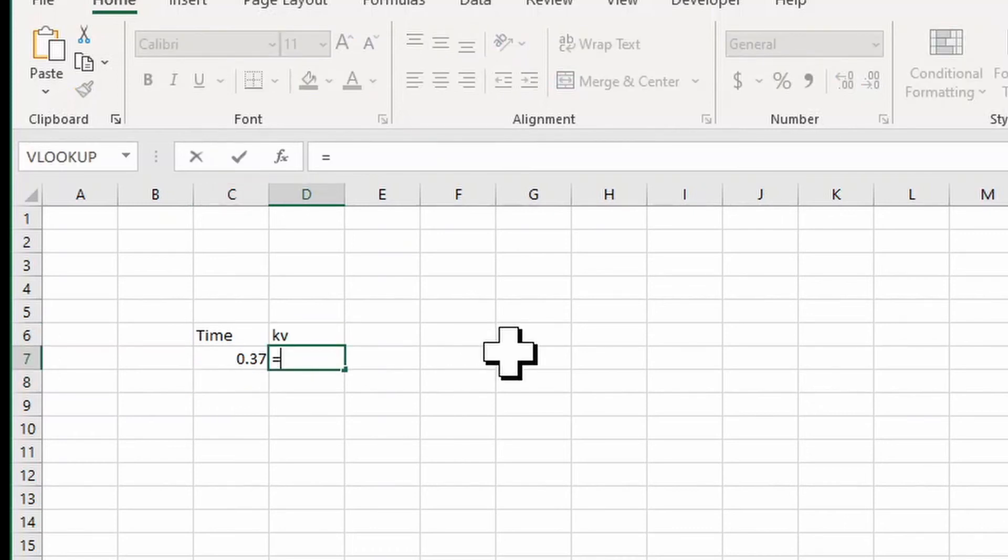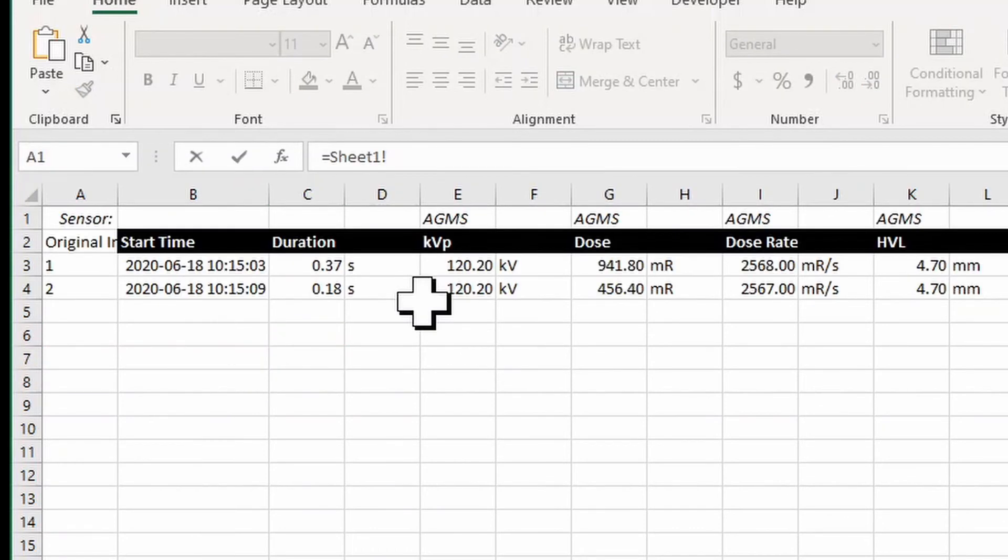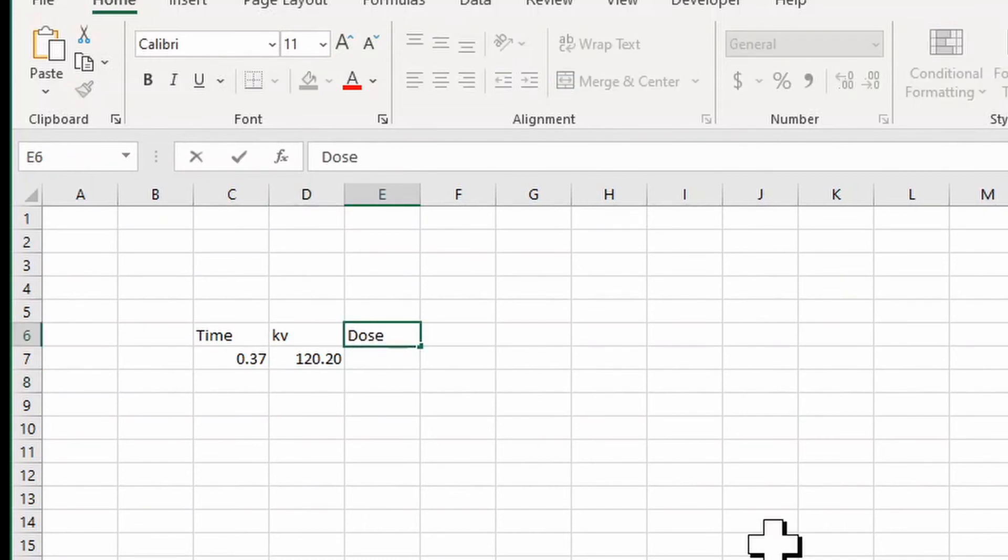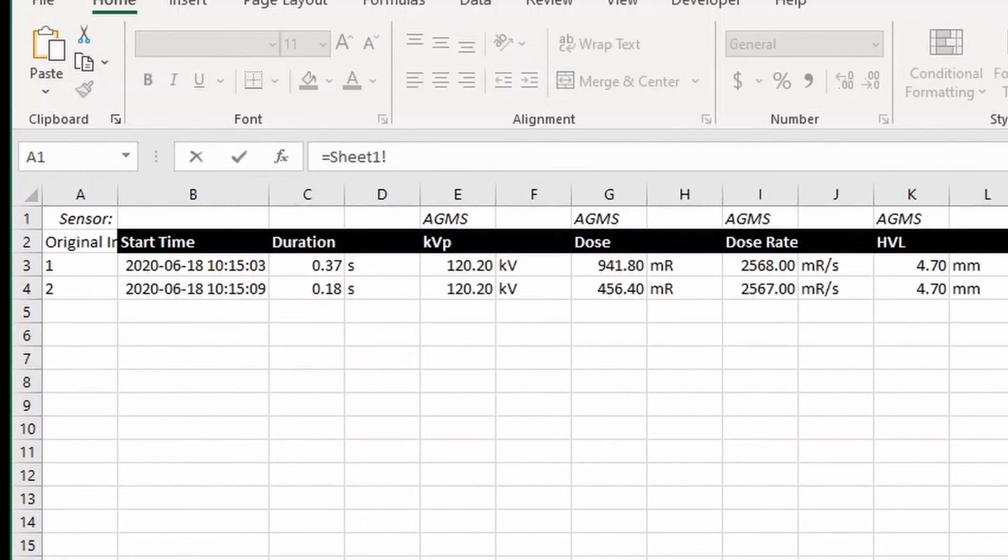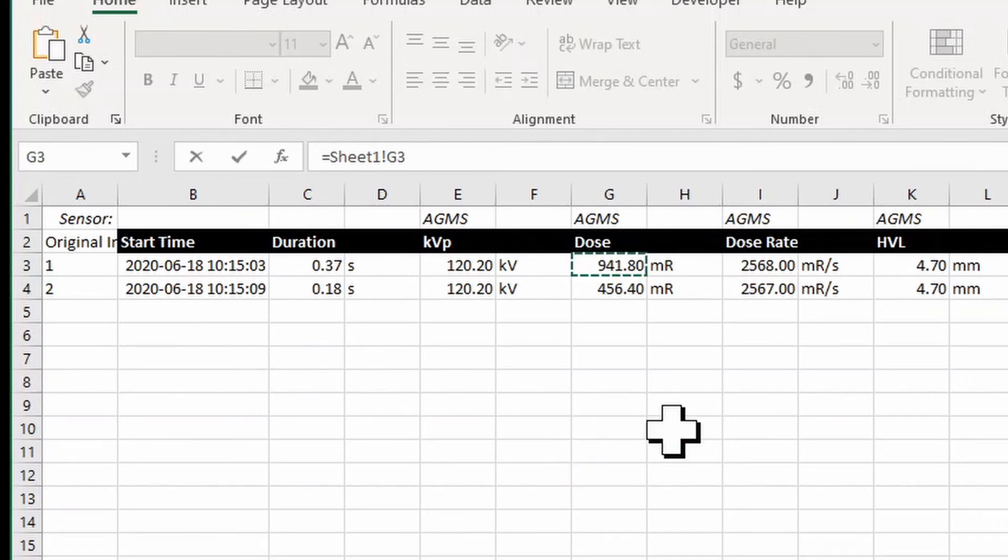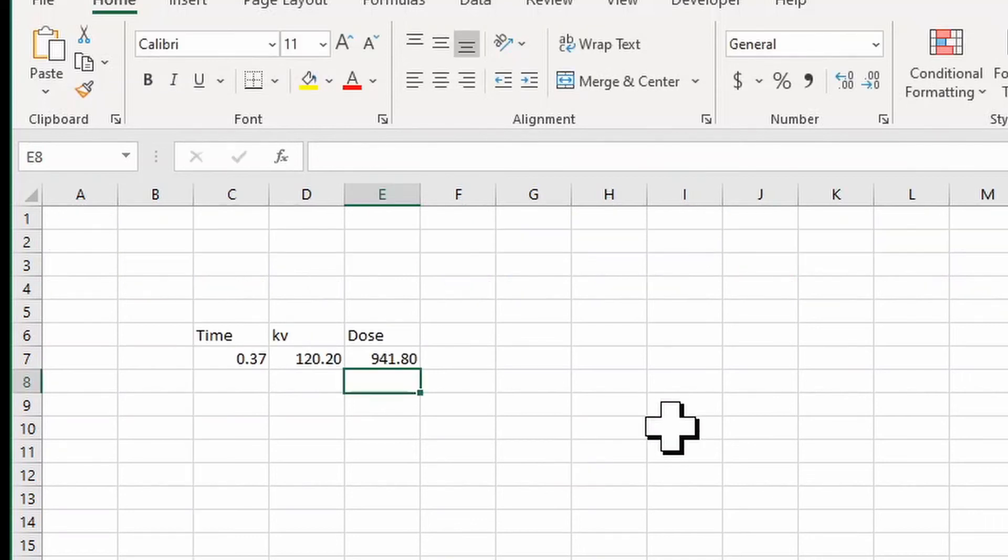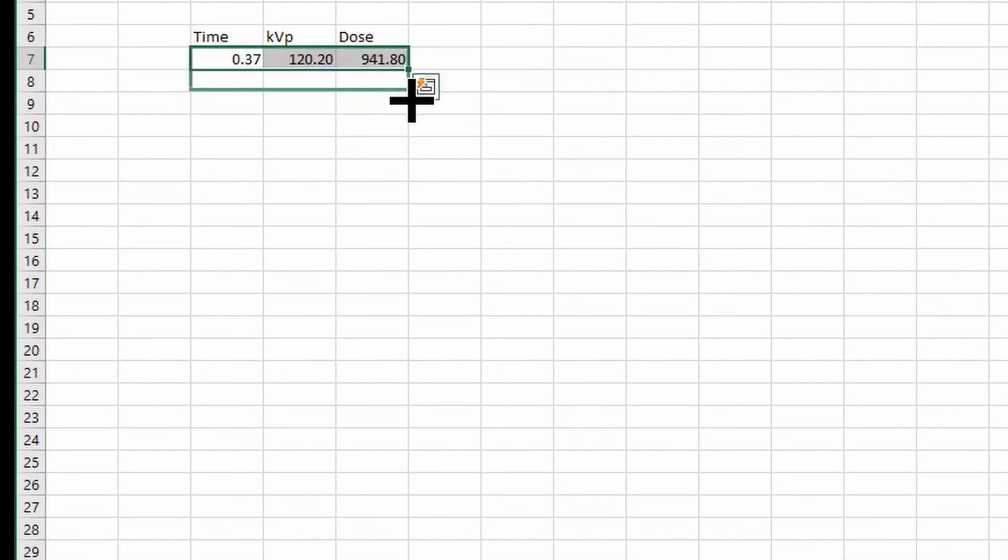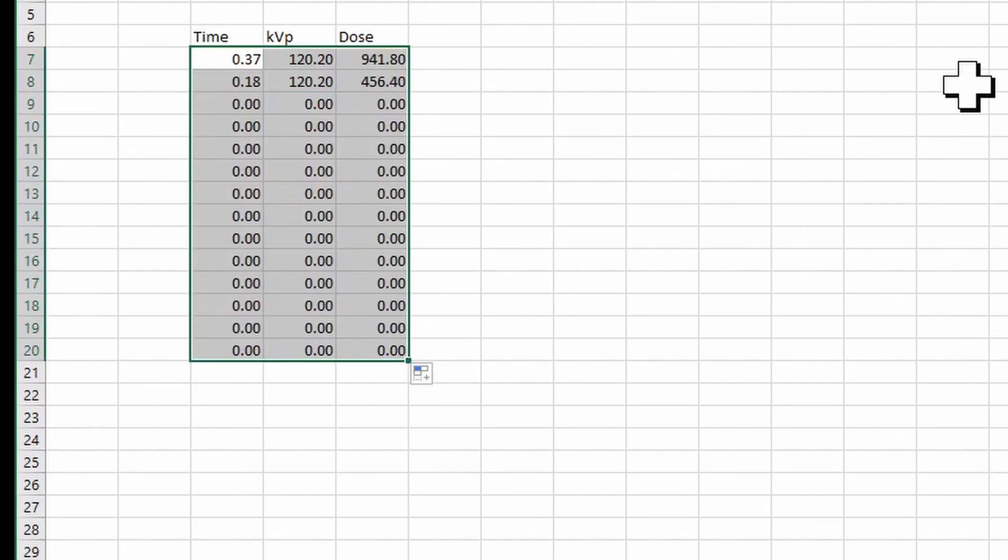We will repeat for KV and DOSE. You will not need to set the reference for each cell manually. We can set the range by selecting the outputs. You will see a small box at the lower right corner of the selected cell. This box is referred to as a fill handle. You can click and drag the fill handle to automatically set the following references.